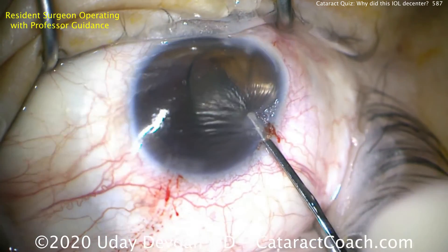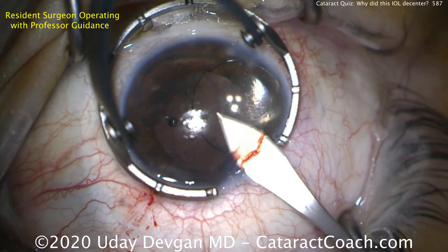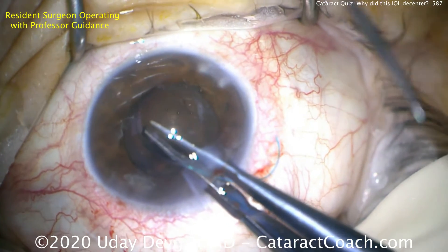So we're just using a spatula now to open up the original incision, trying not to cut a new one. If we need to cut it a little bit, just make sure we're in the same exact path — there's about a three millimeter incision. Using the chopper here to help grab with straight tying forceps.